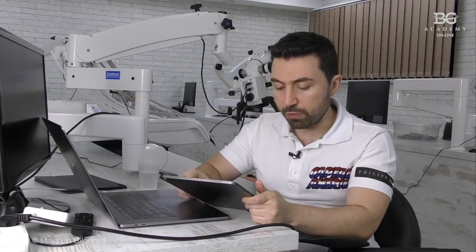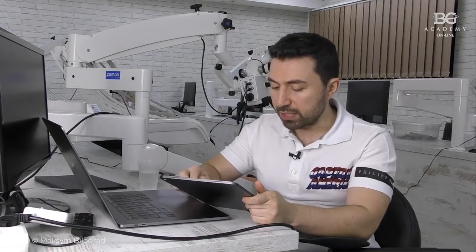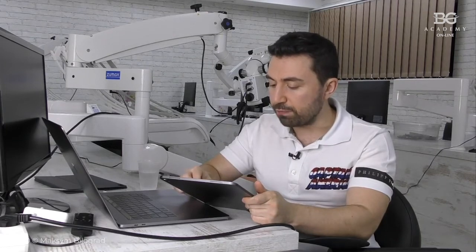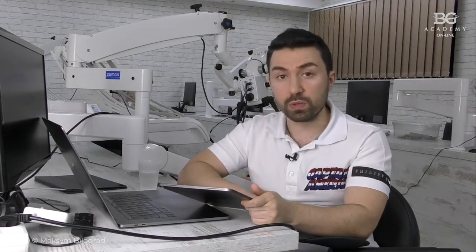The question from Sakina: if a tooth is discolored, do you suggest masking cement? If so, would the translucency of the veneer match the neighboring tooth? In case of discoloration, you have to discuss this case beforehand with your dental technician.